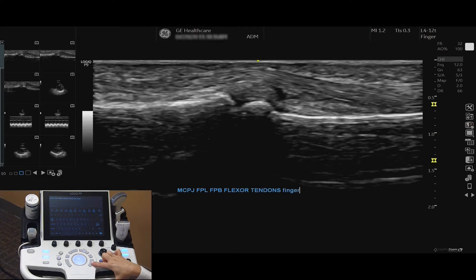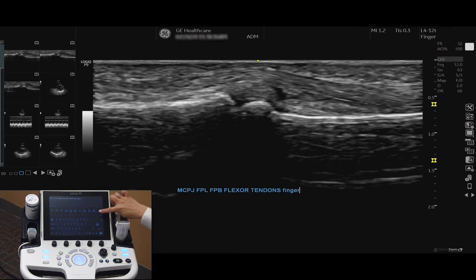Press Set to lock the annotation. To remove comments, use the Backspace or Word Delete button on the touch screen.